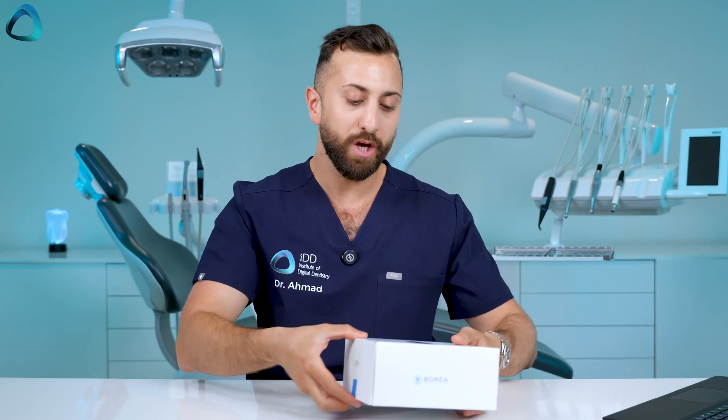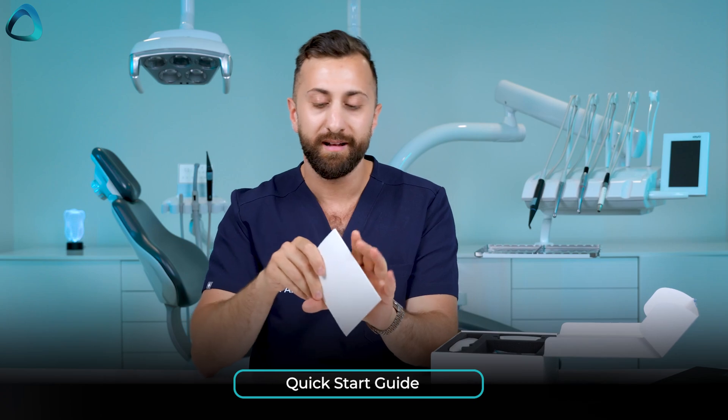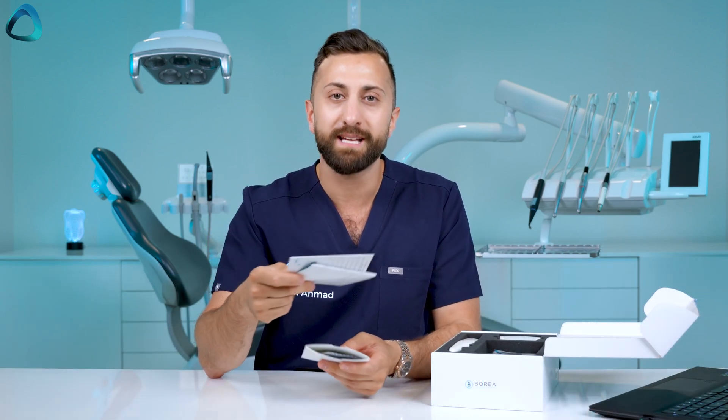Here we have the main Borea Cobra product box — it looks pretty modern with the Borea Cobra right on the front. Opening it up, it's pretty simple and slick. The first thing we see is a quick start guide which covers sterilization manuals and how to use the device, sitting right on top.